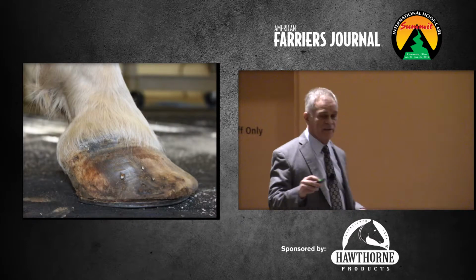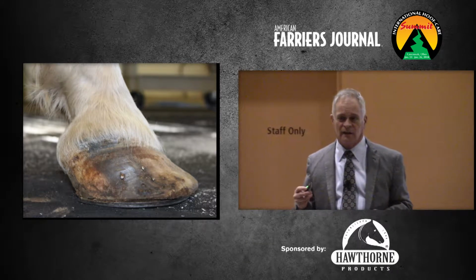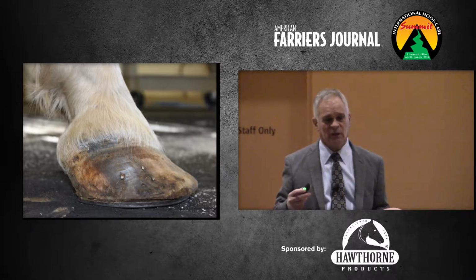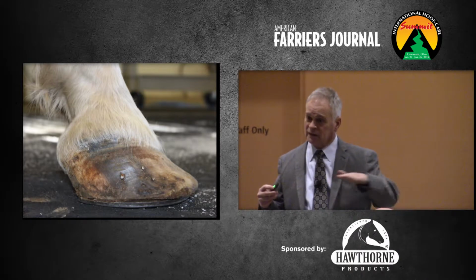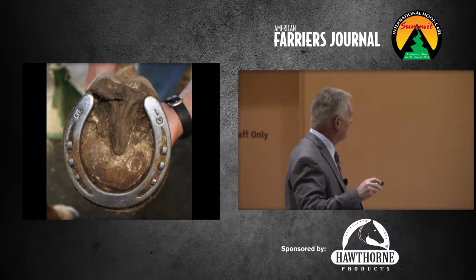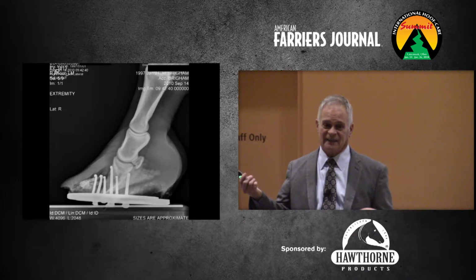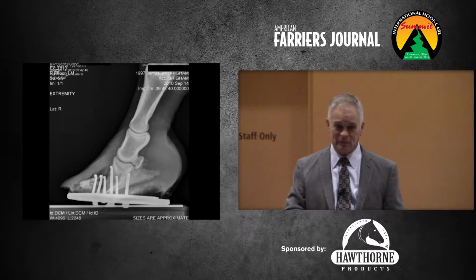Here's another one presented for white line disease they haven't been able to get rid of. And this is funny, Travis and I laugh about it all the time, because he was ready to pull the shoe off and clean the foot up, and I'm like, wait, leave the shoe on because I want it as a reference in the radiographs. The metal is often a good border. So here it is from the bottom. There's our radiograph. When we took that, this horse walked in fine. Just walked right in. So we both gasped, and I'm glad we didn't put a knife on that foot.